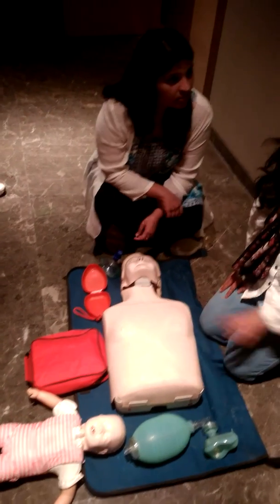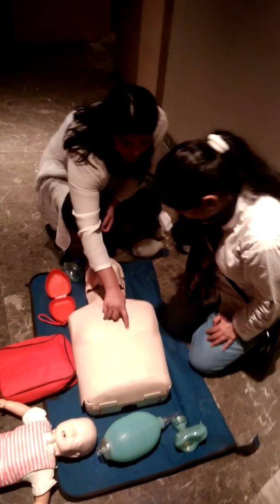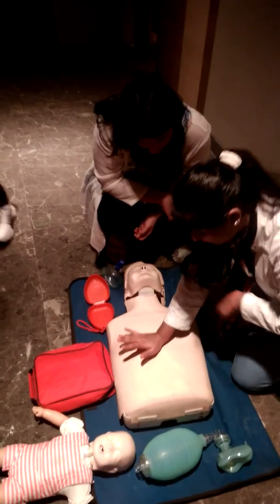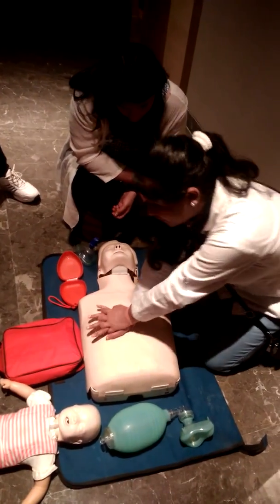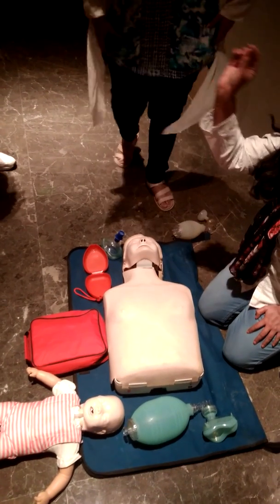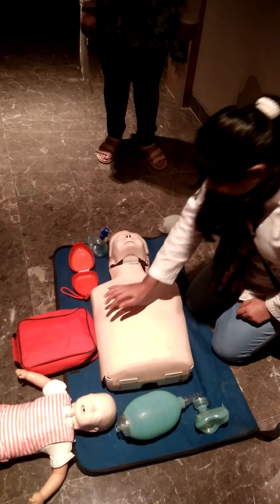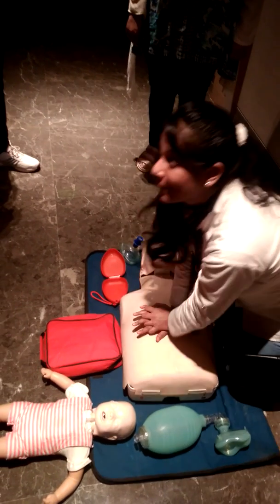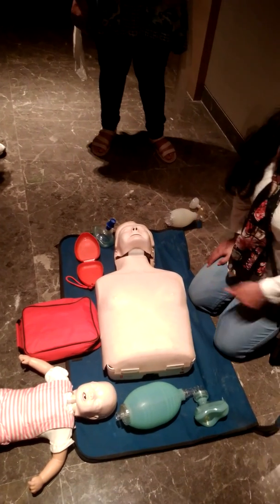The exact place is the lower half of the sternum. These mannequins are made in such a way that if your compression rate and depth is correct, you will hear a click sound. So you can try to hear that sound — if you are doing it correctly, you will hear this click sound.